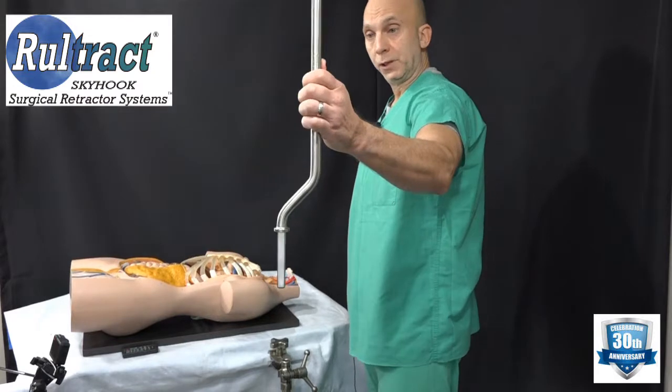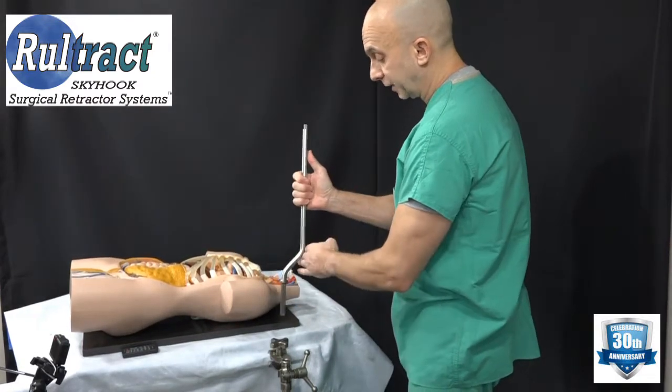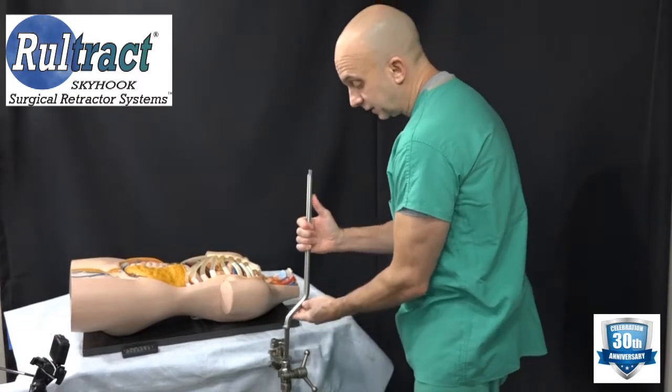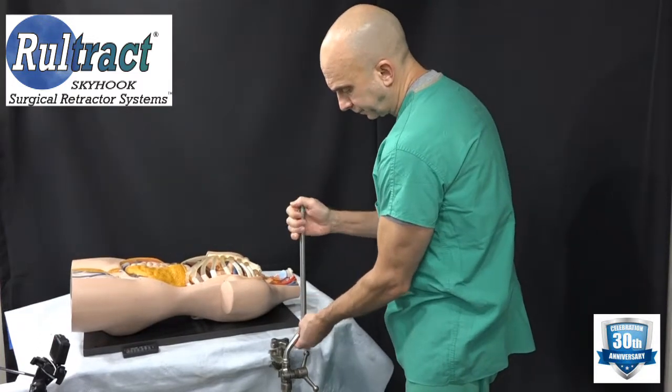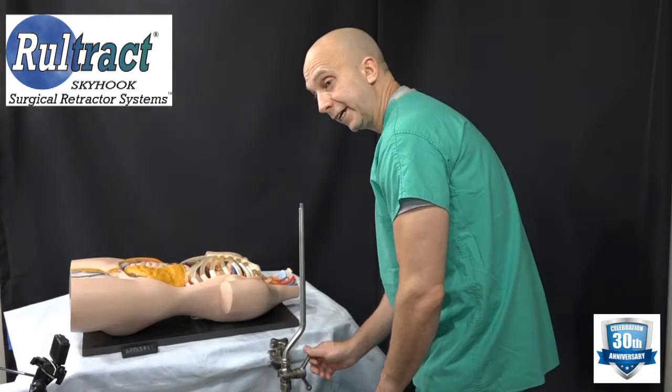Go ahead and take your bottom post. As mentioned earlier, we like to have the bend going out toward the patient's head. Then tighten the wing handle.